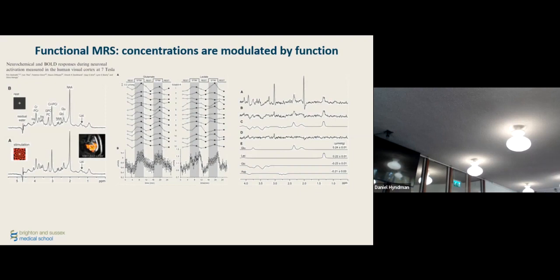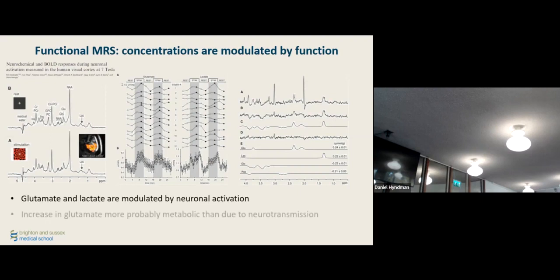These are stimulation periods and rest periods, and you can see that the time course indicates an increase in both. There is a decrease, by the way, in glucose and in aspartate, and this is all according to what we expect to see in terms of glucose metabolism in that particular region following activation. That's, I think, my last word about application, just to get things kind of started with respect to what can we do with this.